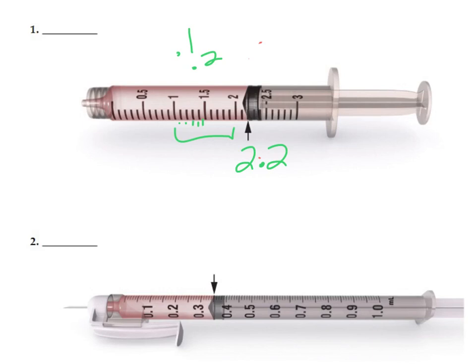Very, very similar to the image just above it where we saw 1 to 2. It's just the distance between 0.1 and 0.2 instead. Again, we've moved the decimal to the front of the number, but it's still 9 markings in between. So we're counting it off very similarly, except instead of 1.1 and 1.2 like we had on the first one, this is going to be 0.11, 0.12, 0.13, and so on and so forth, between the 0.1 and the 0.2.